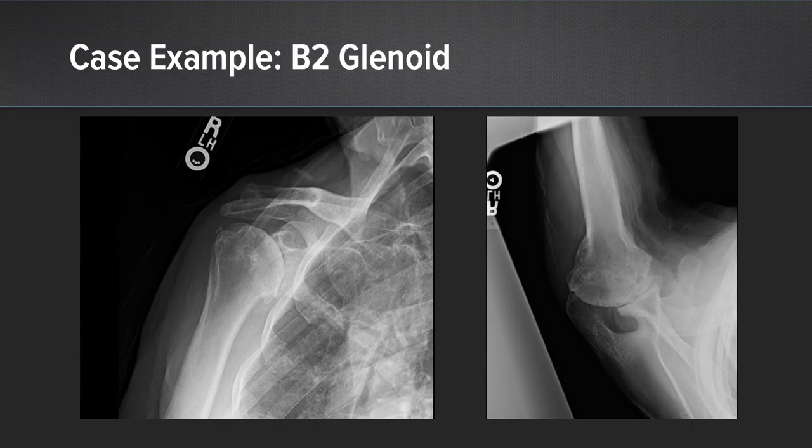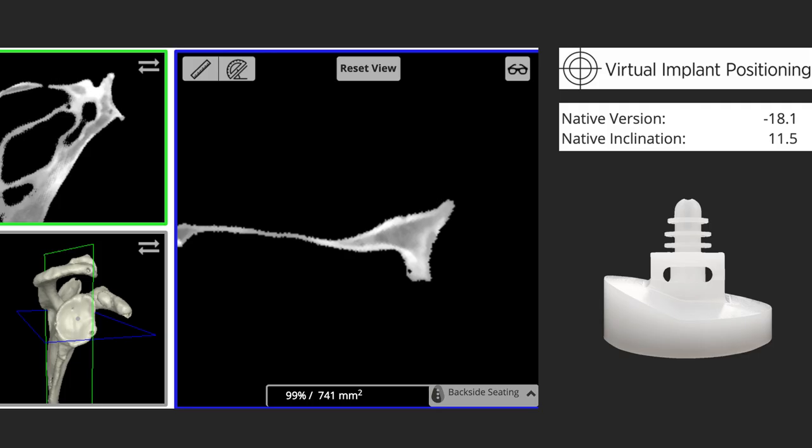This is a mild B2 glenoid deformity. You can see a little bit of posterior wear on the axial view. We put this in the CT scanner and VIP, and we see there's 18 degrees of retroversion — falling into that middle range that I think is idealized for an augmented implant, between 15 and 25 degrees. So this is an excellent candidate for an augmented posterior glenoid.